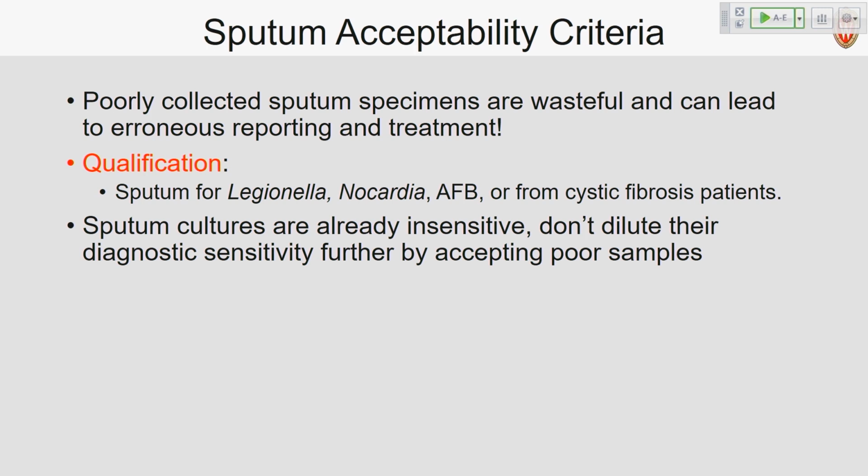But really, the big thing here is that sputum cultures are already an insensitive diagnostic test. The acceptability criteria need to be applied, because accepting anything and everything into the lab is going to further dilute that diagnostic sensitivity and contribute to unnecessary laboratory workup.